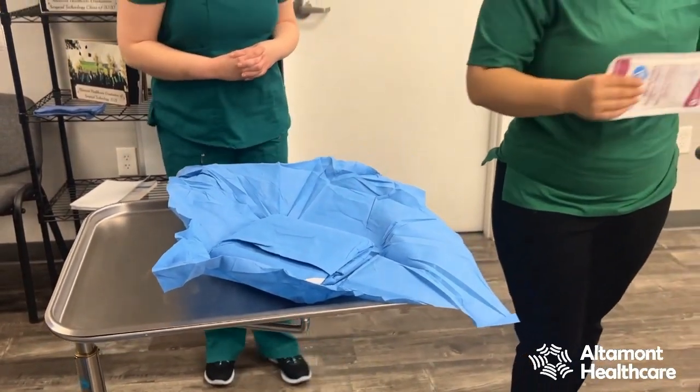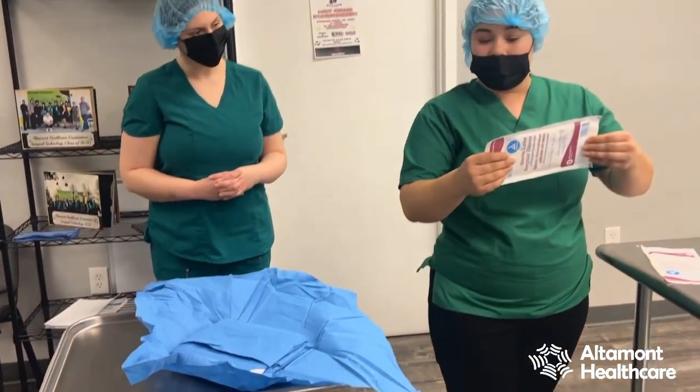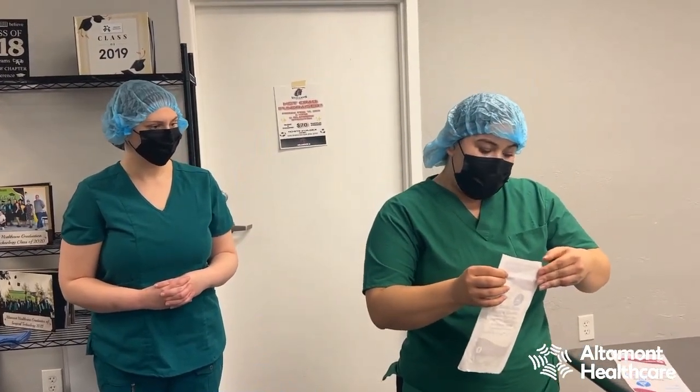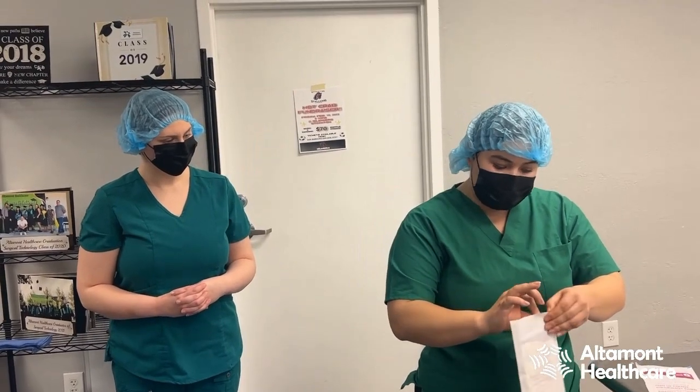The next step is to pop my gloves open. I always recommend — and typically so does every other facility — to double glove. The reason being is if you are in a surgery and you had a strikethrough, that second pair of gloves can indicate whether or not there was a cut in your glove, and it might just be the reason you're safe from contaminating an entire sterile field.